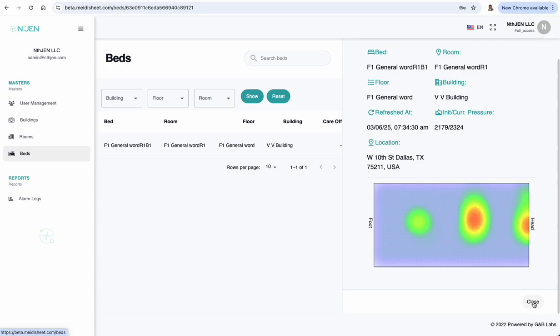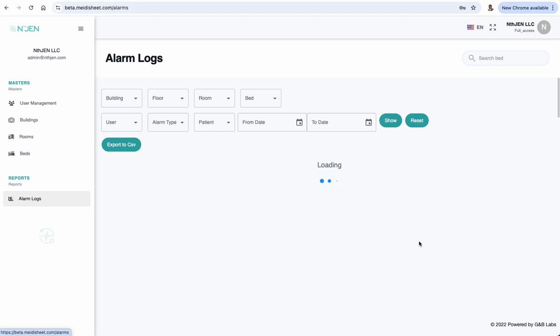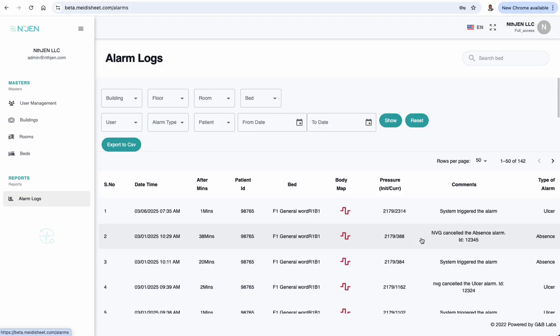Since this is a high pressure level, what it will do is it will look for 45% of the sensors to change for it to actually reset the alarm. All right. So now that we're back in here, one of the things that we're going to go to is the alarm logs. I'm going to show you the alarm log, and hopefully our subject stays steady.